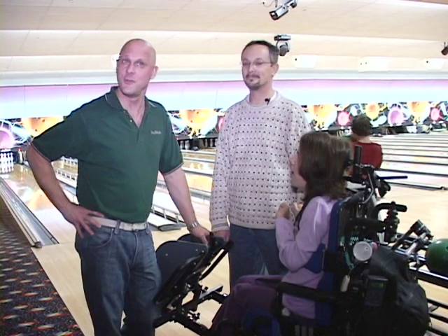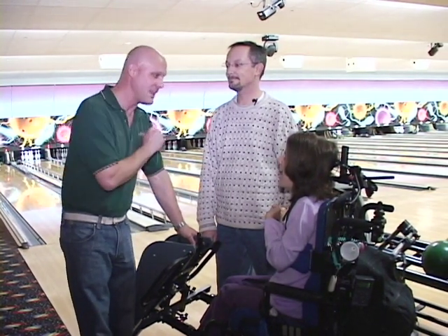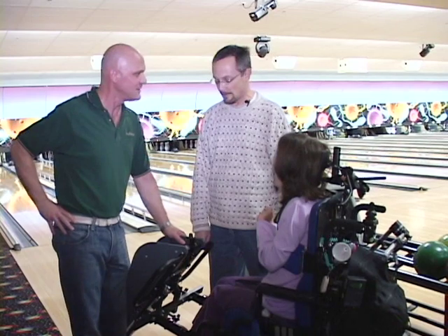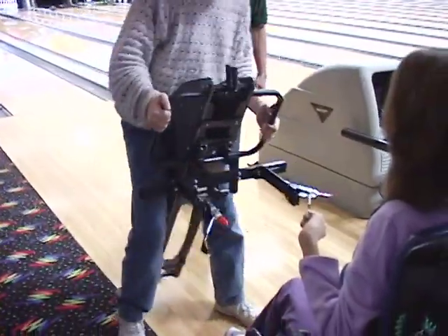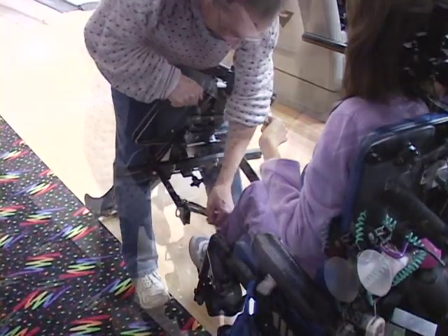Okay, here we are in Andover, Minnesota at the Andover Lanes, and I'm here with Scott Price and Vicki Price, and we're bowling out of a wheelchair. Can you tell us a little bit about it, Scott? Well, Victoria has the I-CAN bowling arm, and she uses that, which attaches to the front of her chair. I see it snaps onto the wheelchair with these two clamps, not real tough. Nope, and then just a couple of alignments.